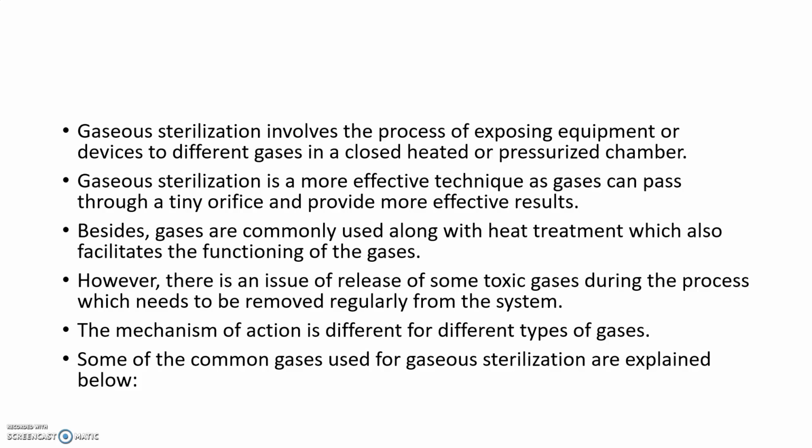Gaseous sterilization involves the process of exposing equipment or devices to different gases. How? In a closed, heated or pressurized chamber. It is a more effective technique because the gases can pass through the tiny orifices of the exposed equipment, and this may provide more effective results. Besides, the gases are commonly used along with heat treatment, which also facilitates the functioning of the gases.